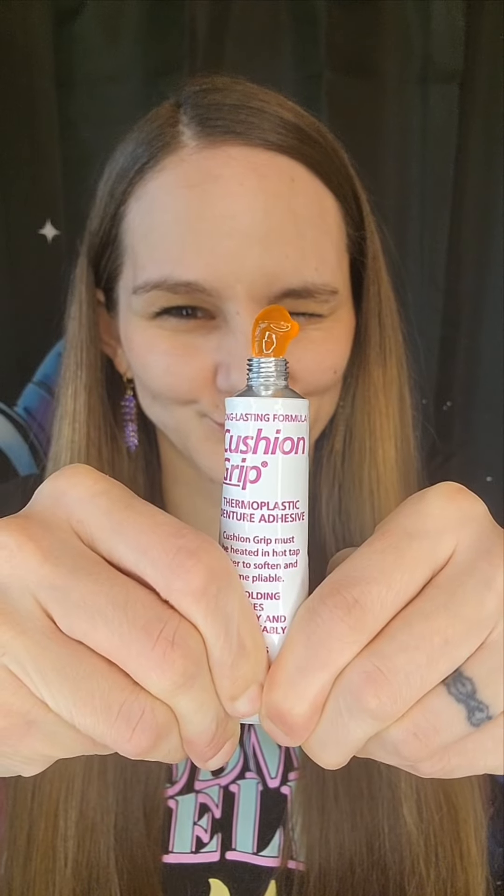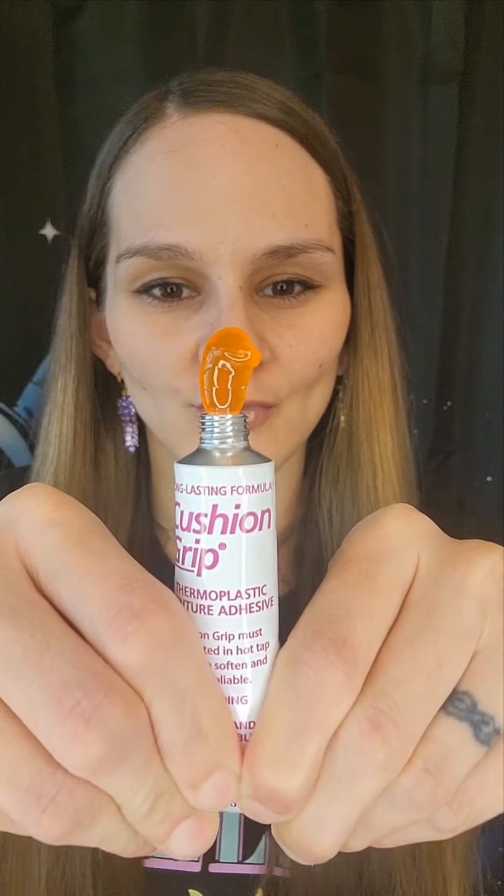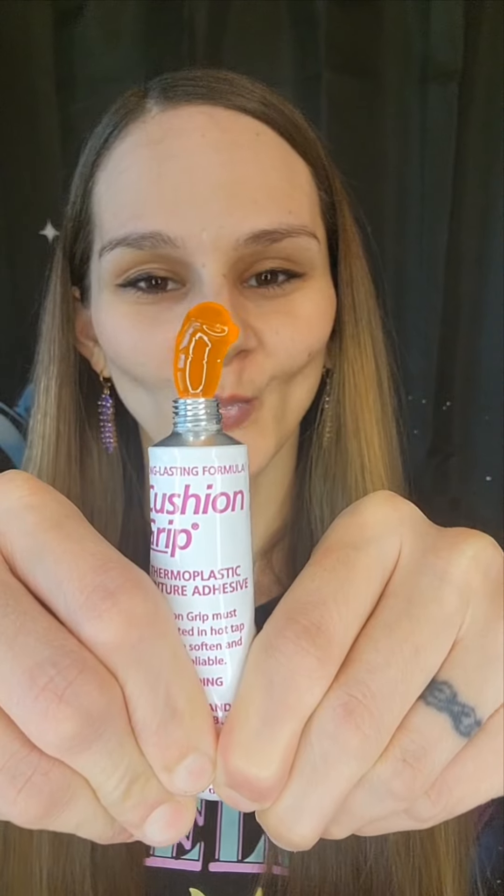Now that our cushion grip is ready, it's nice and warm, we're going to go ahead and open it up and get ready for use. You're going to squeeze from the bottom until you start to see a nice little orange bubble pop out — just like that. How much you're going to need just depends on you and your denture. You may have to experiment a little bit and see what works for you.